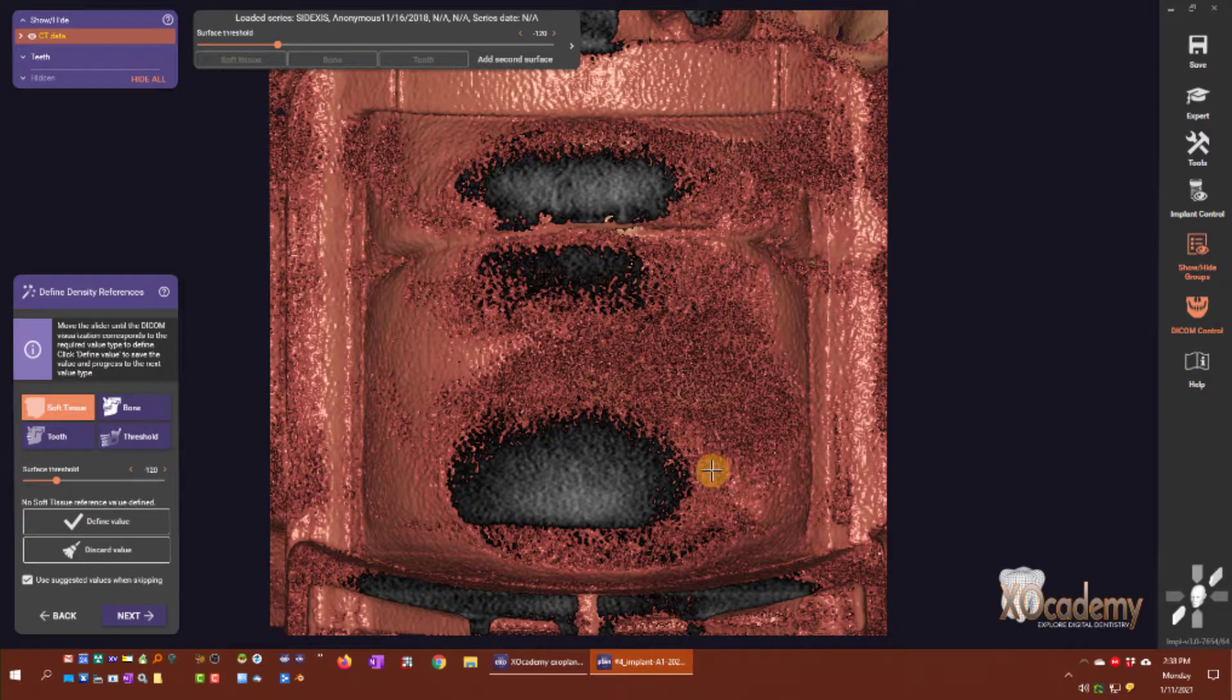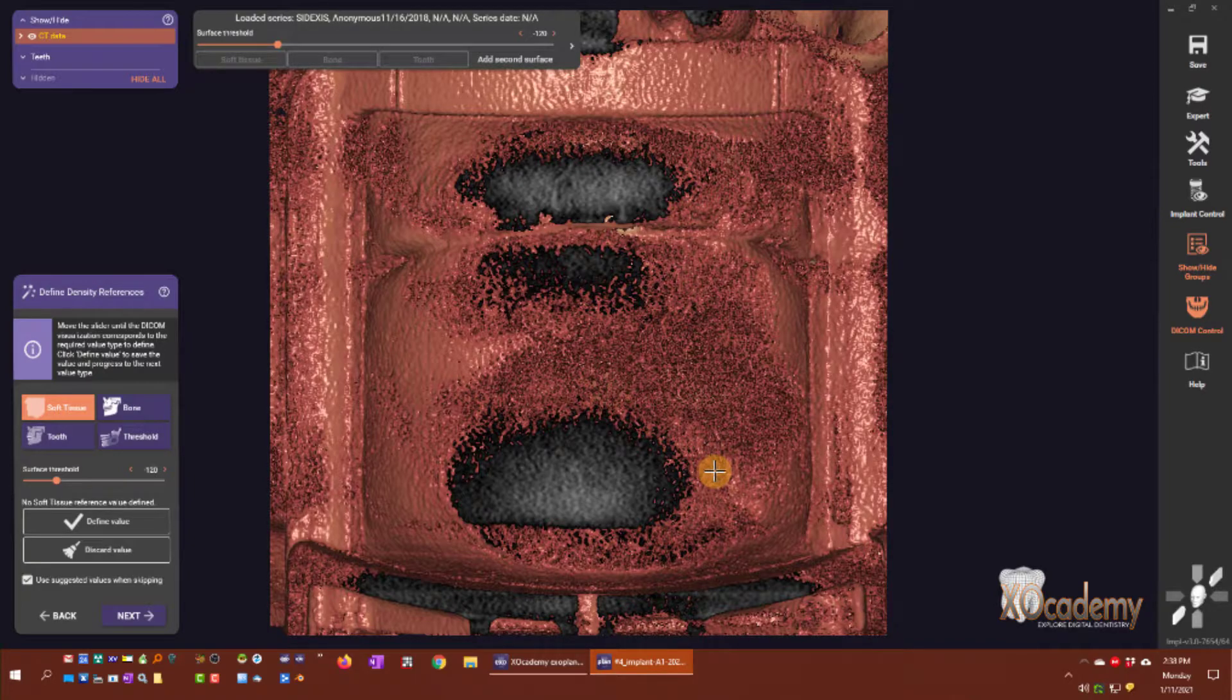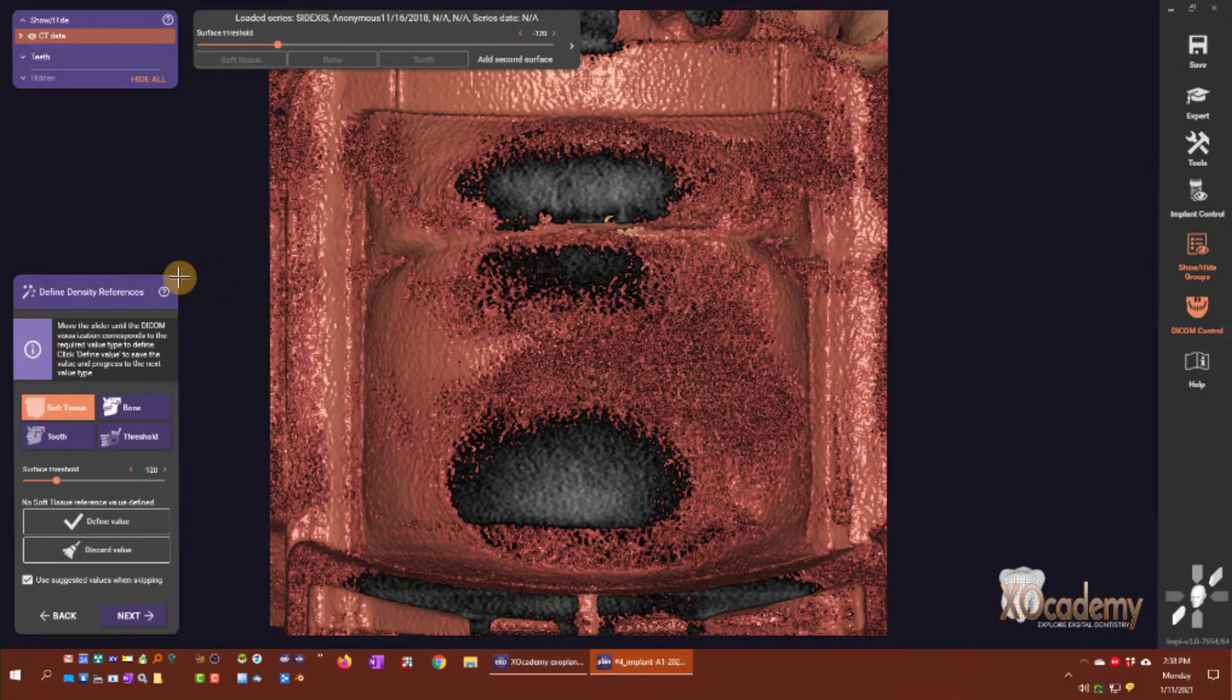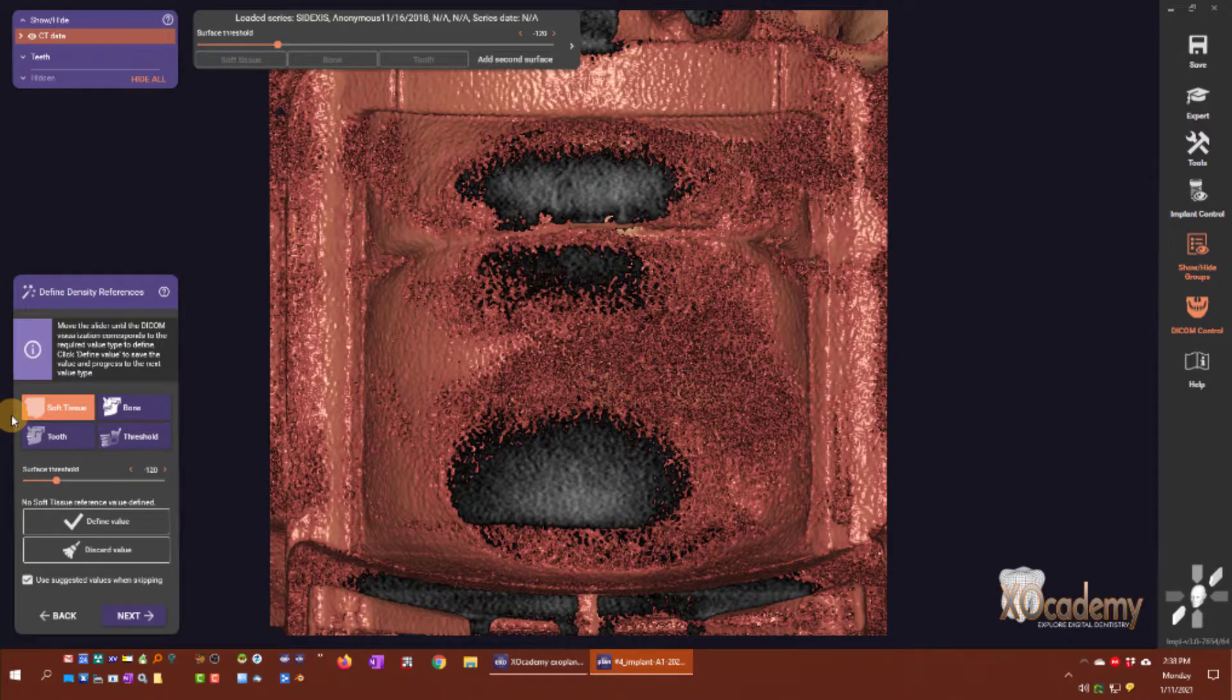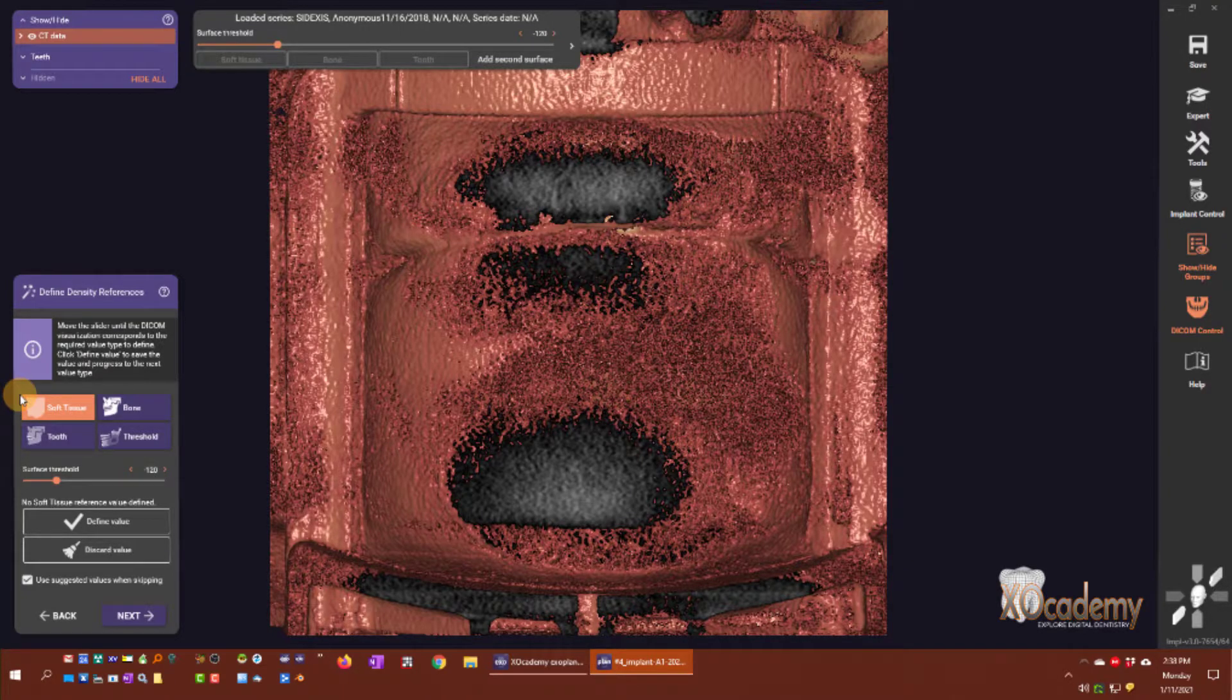The first step in the wizard is to define the density references. You'll see here in the wizard box on the left we have soft tissue, bone, tooth, and threshold. We need to define each of those.